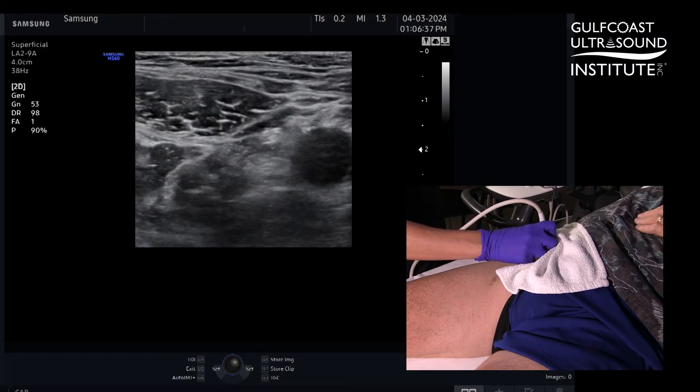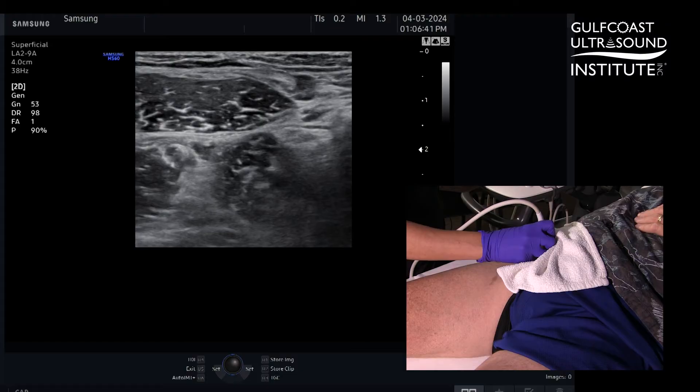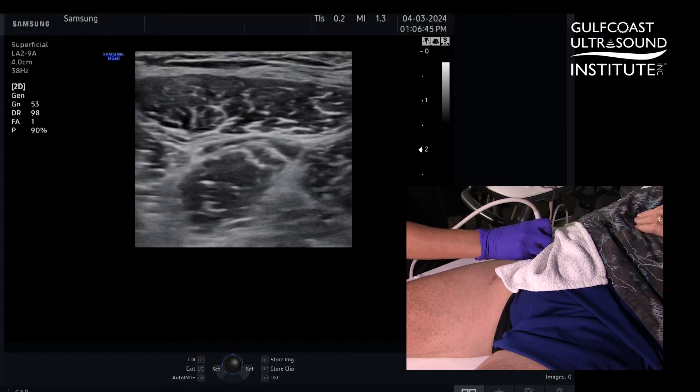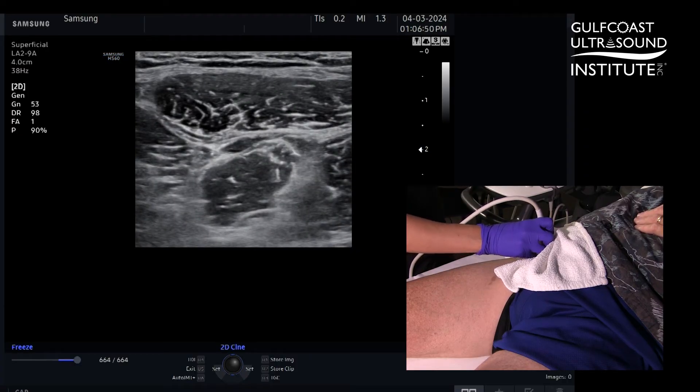The great thing about this fascia iliaca plane block is that you're not actually dumping anesthetic at the nerve. You are depositing the anesthetic in between this fascial plane. It's very safe and generally very easy to do.